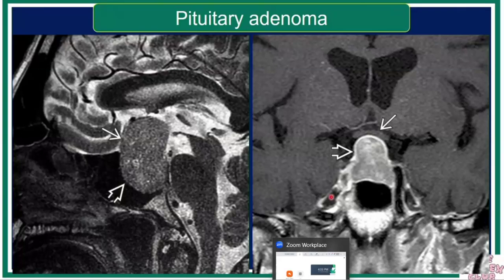So, for example, the VIBE technique. And also, I think it's important how thin the section is for the pituitary. So not all MRI scans are created the same. It depends how many Teslas, it depends how thin. So what would be your recommendation for the tumor that is not found on the regular MRI, even on the dynamic Sellar?